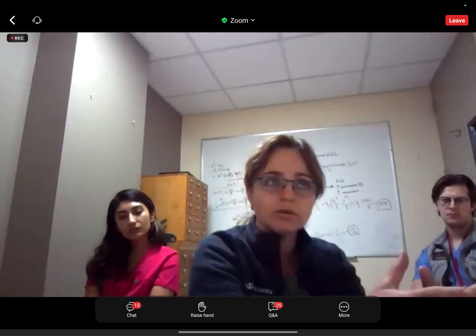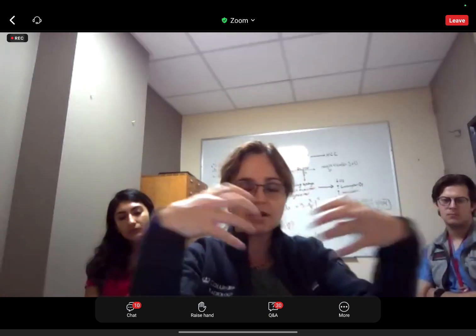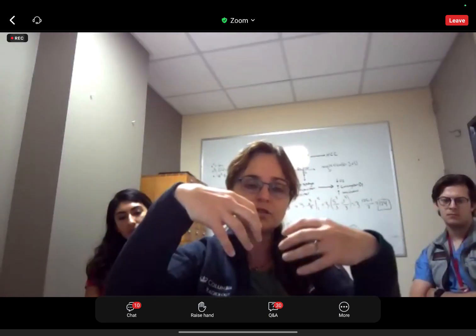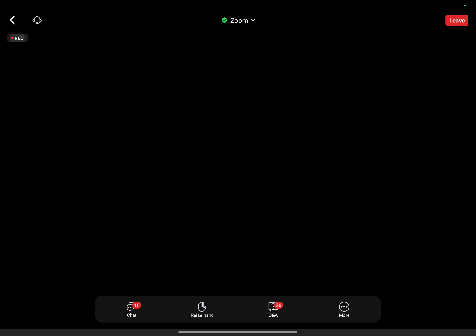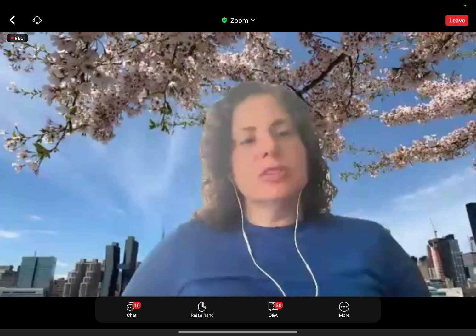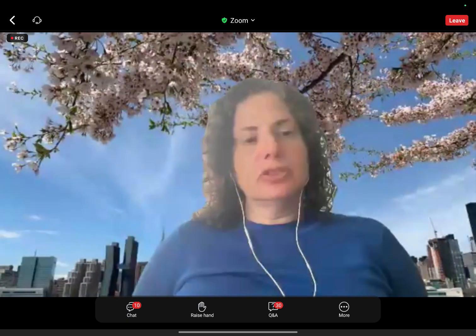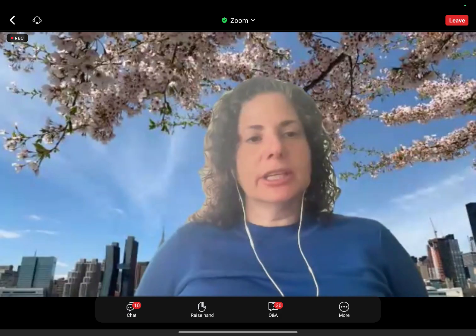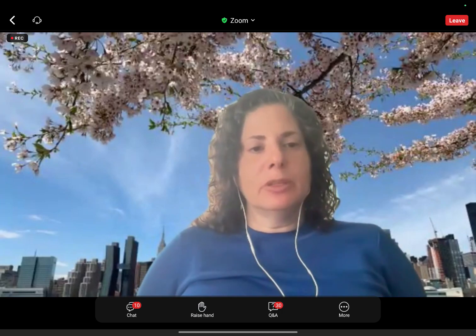There are plenty of people who like spectral CT, but the overlap of people who are interested in HCC, LI-RADS and spectral CT, that Venn diagram doesn't overlap much. Currently there's probably nobody using spectral to get the data, let alone apply it to LI-RADS. So certainly we don't have all the answers on that, but again, we rely on LI-RADS.